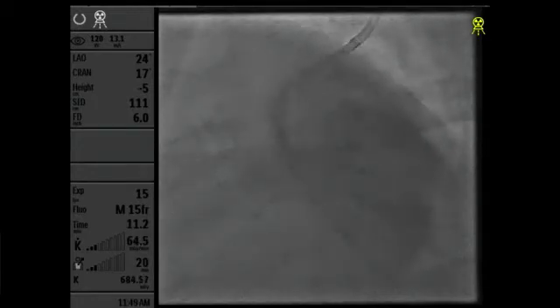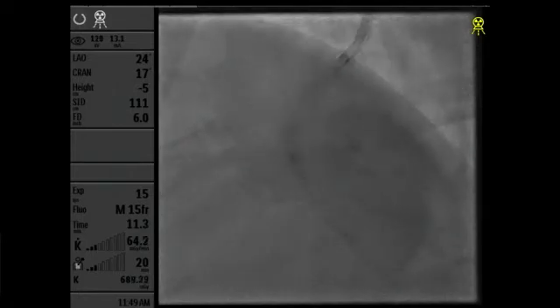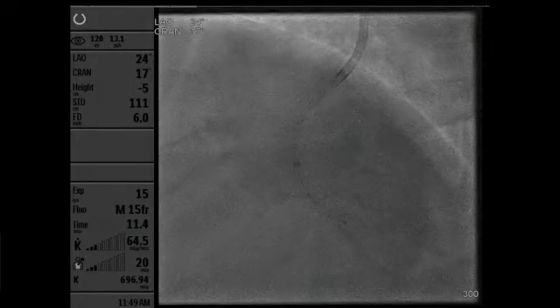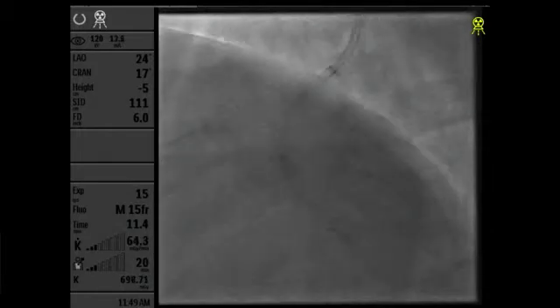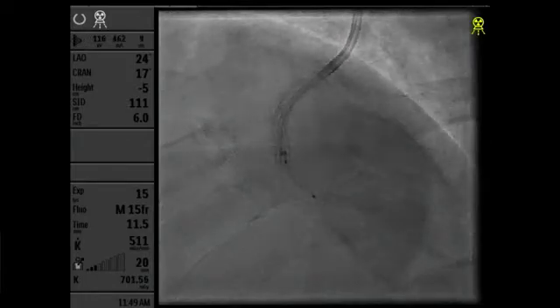So, Dean, can you remember the exact number of pre-dilatation? What was the percentage of pre-dilatation? 47%. Okay. Less than half were pre-dilated, and 60+% were radial use in our trial. And that's quite a lot of guide to go back a little, right?